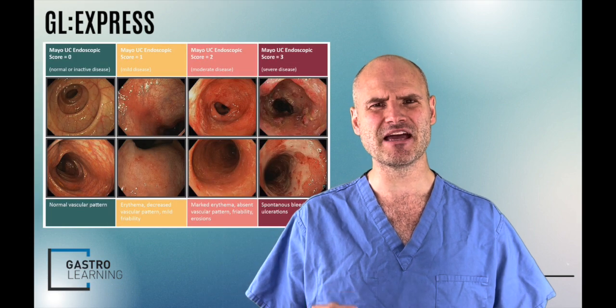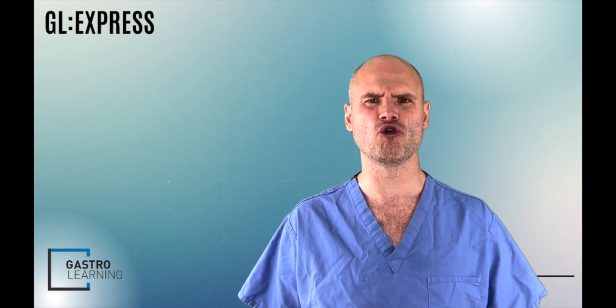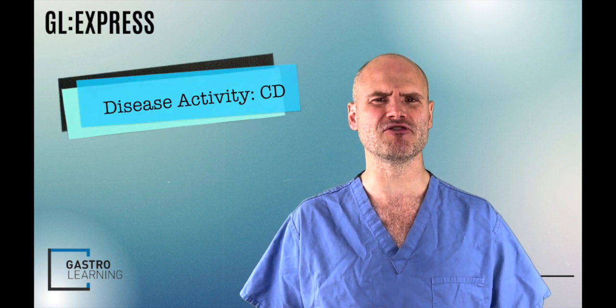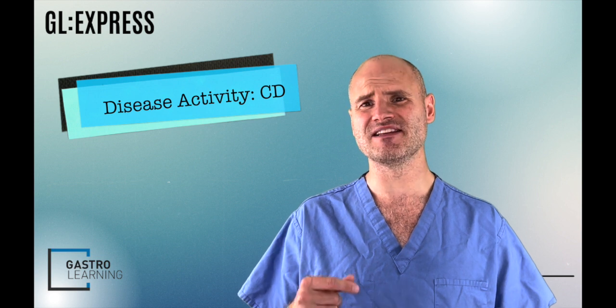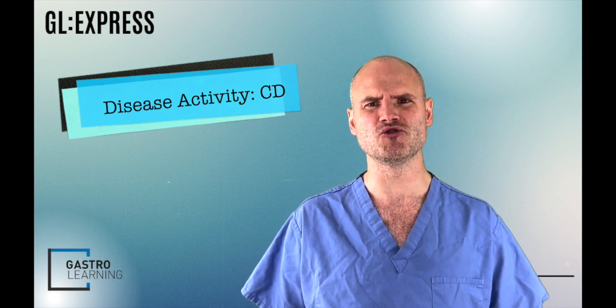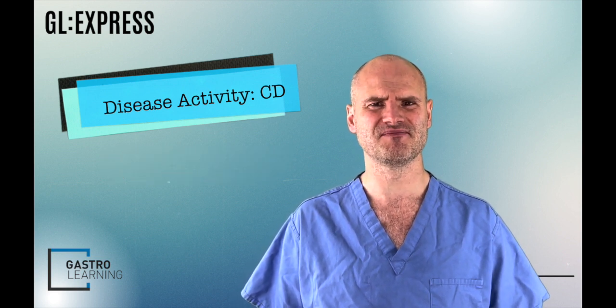They suggest that the Mayo endoscopic score is the easier to use and thus perhaps is the endoscopic score of choice. Activity scores in Crohn's disease are more complex, and as such the working group agreed not to include these scores in their recommendations. However, they did suggest that where feasible, an endoscopic score for Crohn's disease should be used, and again they suggest here the simple endoscopic score for Crohn's disease.